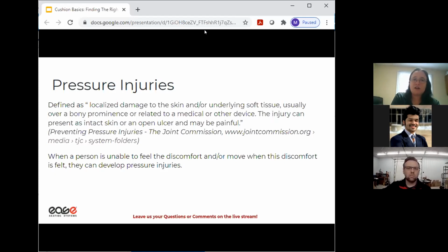So when you're looking at your bottom or where you're sitting, like underneath this hip, there really aren't any pointy areas. But as you get towards your hips, you have two bones that are sticking down called ischial tuberosities. Those are a very common area to get a sore because, again, there tends to be not as much muscle or fat underneath there. You also look at your tailbone, or the coccyx, which is another hot spot where people tend to get pressure injuries. So now generally these injuries are caused by either a constant pressure there or a shearing injury where they're moving, but the surface they're sitting on doesn't move with them.